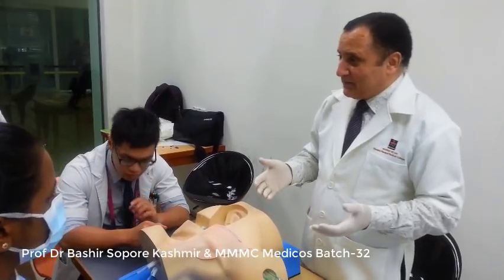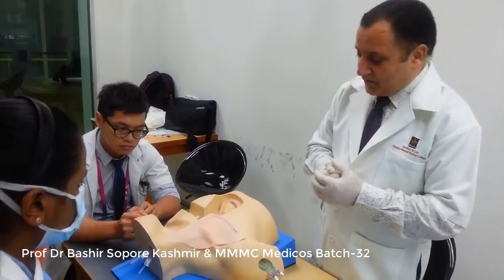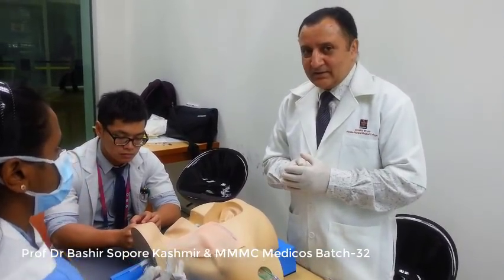Now we move to the steps. So you can show us now the steps. How are you going to perform the jugular venous catheterization?